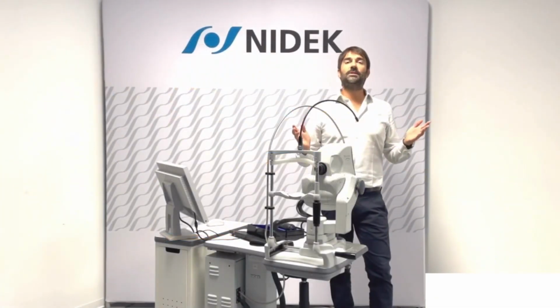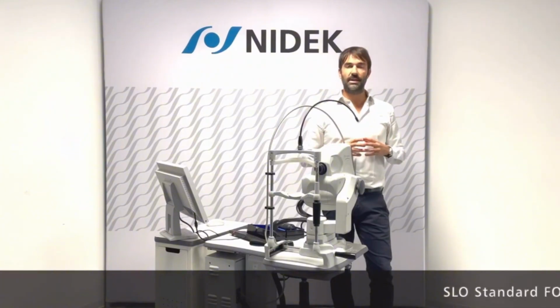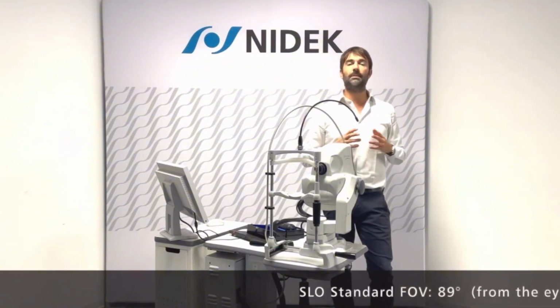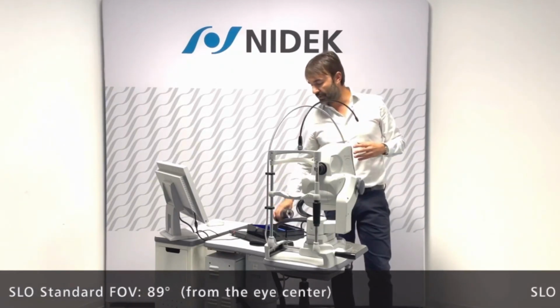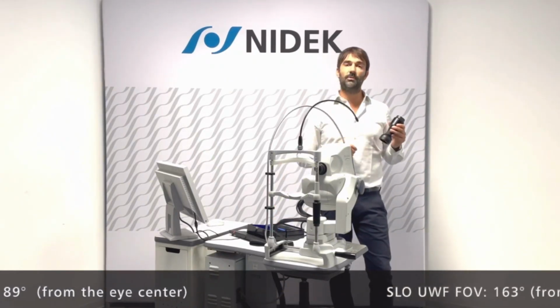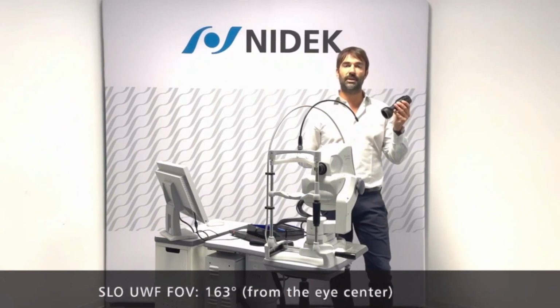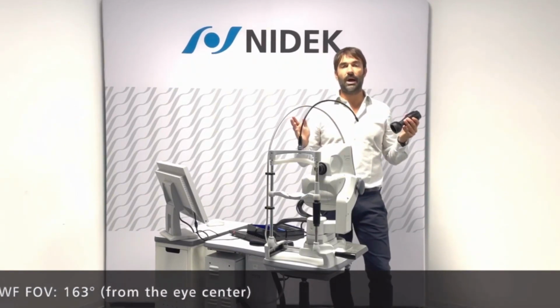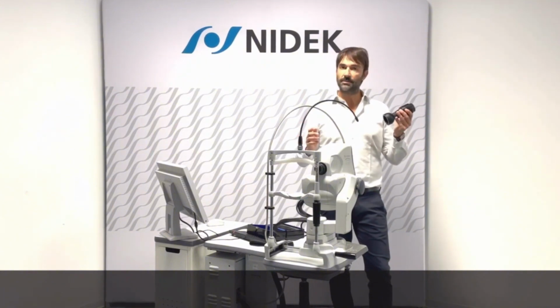So the images we've seen so far were taken in standard field, which corresponds to 89 degrees in diagonal for SLO-based images and up to 16.5 millimeters for OCT scans. But remember that in FA, ICG, retromode imaging and color imaging, thanks to this extra attachable ultra-wide field lens, we can expand the field of view up to 163 degrees. Let me show you how it works.